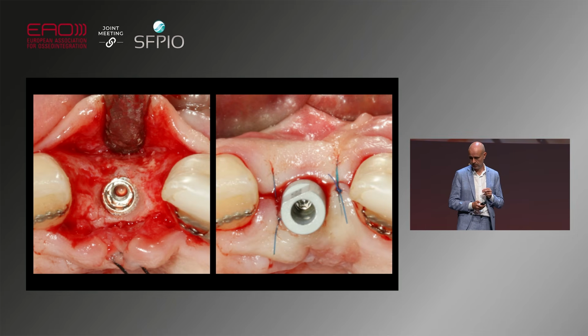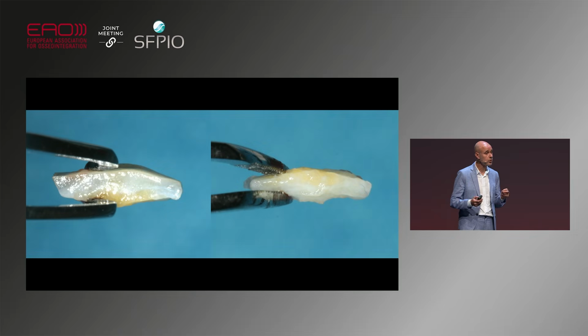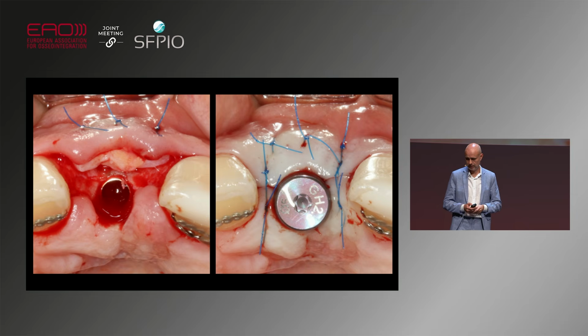We make the impression, and of course, we continue by augmenting the soft tissues. This is a free gingival graft that needs to be de-epithelialized. You can do that intra or extra-orally. And then you make sure that you reverse this connective tissue in order not to have aesthetic complications in the end if you have some remnants of epithelium there.